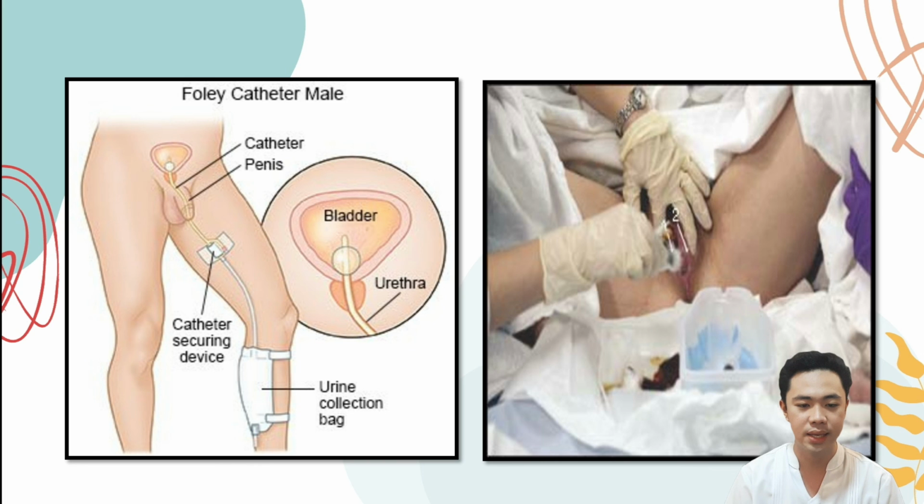If necessary, attach the drainage end of an indwelling catheter to the collecting tubing and bag. Next, examine and measure the urine. In some cases, only 750 to 1000 ml of urine is to be drained from the bladder at one time. Check agency policy for further instruction if this should occur. Remove the straight catheter when urine flow stops.